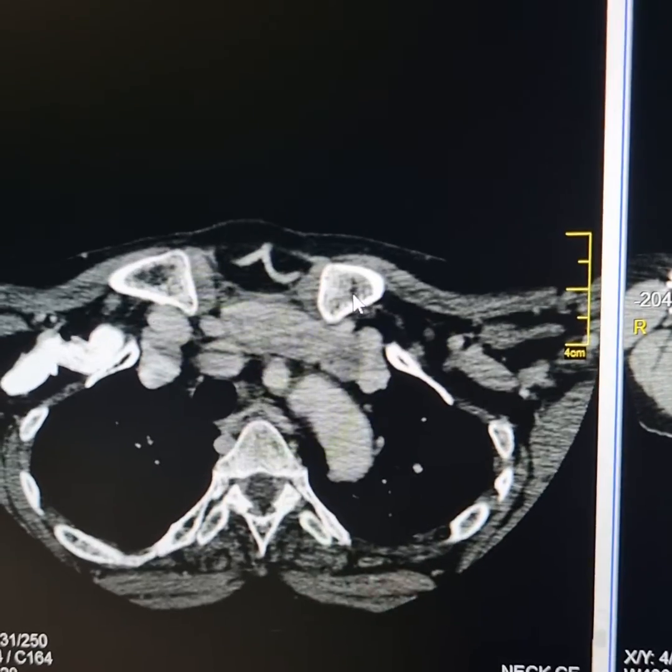We must always take help from the CT scan to assess retrosternal extension. You can see there is a slight retrosternal extension, but it is not gross, not profound, and there is no significant displacement of the mediastinal structures and the blood vessels.